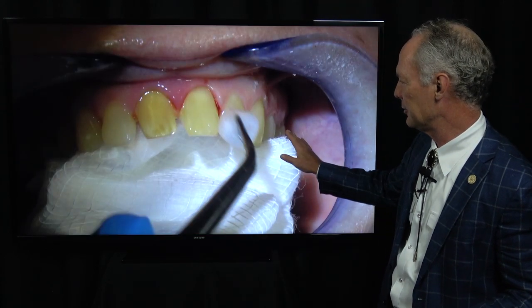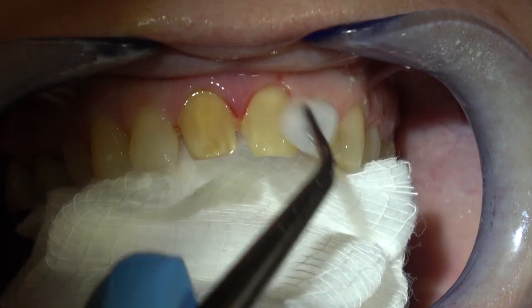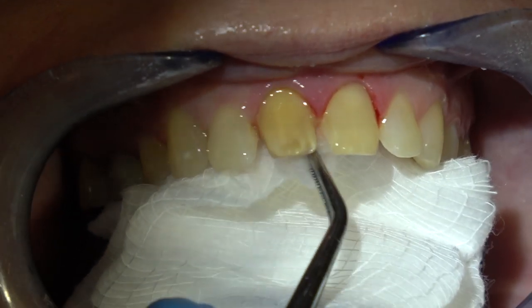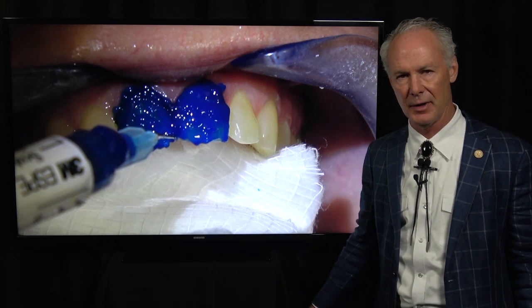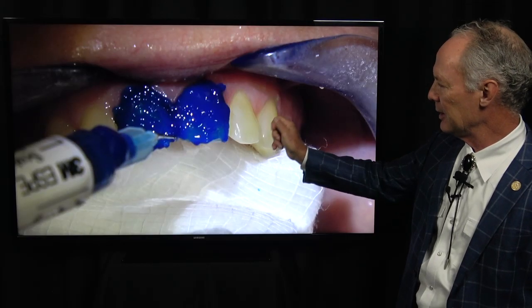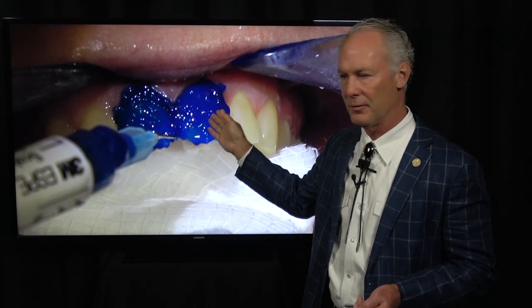This is a really hard shade match because of the dark tooth and the fact the adjacent teeth are a little bit yellow. I'm going to wipe the tooth again with isopropyl alcohol, then apply the 38% phosphoric acid. Not only does it etch the teeth, it's also a fantastic hemostatic agent. If you've got any bleeding, put some 38% phosphoric acid on it for 45 seconds and it will stop the bleeding 99% of the time. Use a water bottle with a large tip and ice cold water to rinse it off — don't use your air-water syringe or you'll break the scab and elicit bleeding again.